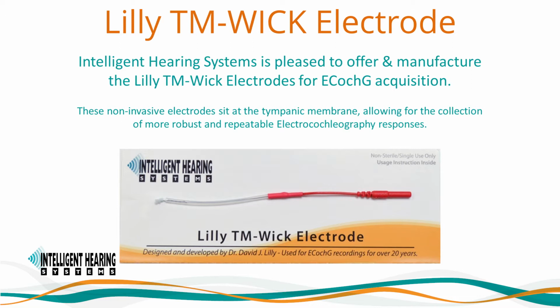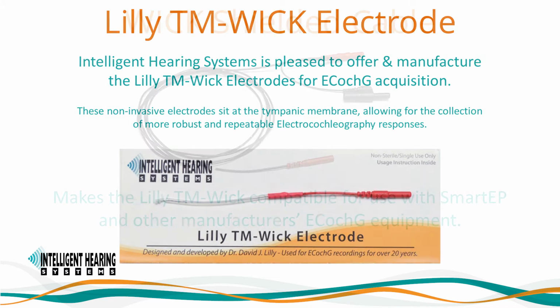These non-invasive electrodes sit at the tympanic membrane, allowing for the collection of more robust and repeatable electrocochleography responses. The Wick option is the perfect compromise and the smart choice between the invasive transtympanic electrode and the non-shielded, further away from the site of generation, in-ear canal Tip-trode electrode.